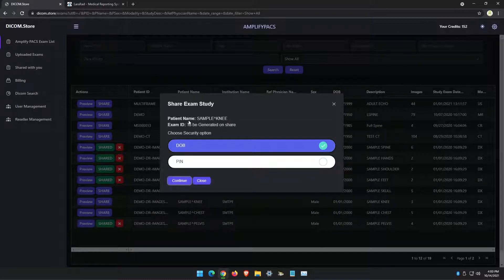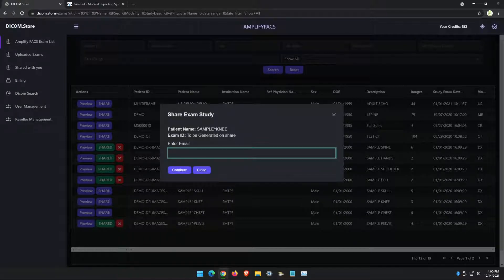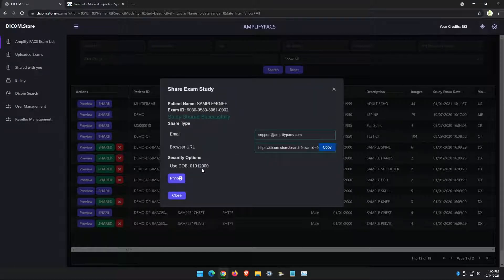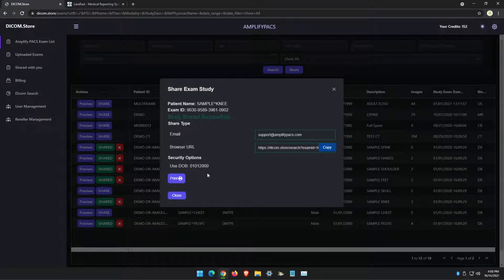We click continue, and we select the security option for sharing the exam. I'm going to leave it as default date of birth, and you enter the email address of the person that you want to share the images with, and you click continue. The email recipient will receive instructions on how they can open up and view the images. They will need to know the patient's date of birth if you're using that security option.